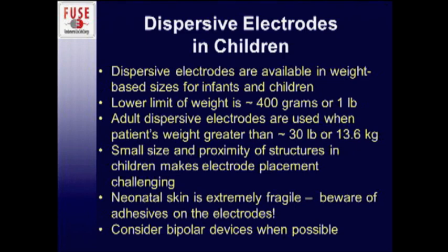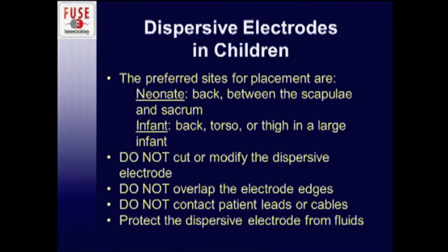And I will remind you, if any of you do have the occasion in a rural center or in an emergency setting to operate on a neonate, that their skin is extremely fragile, but this is the same as true for elderly women also. Beware of adhesives on the electrodes and consider bipolar devices whenever possible. Now, many of the guidelines for placing electrodes are going to be the same as adults, but they warrant repeating for children because the placement is more challenging, again, because of the size.